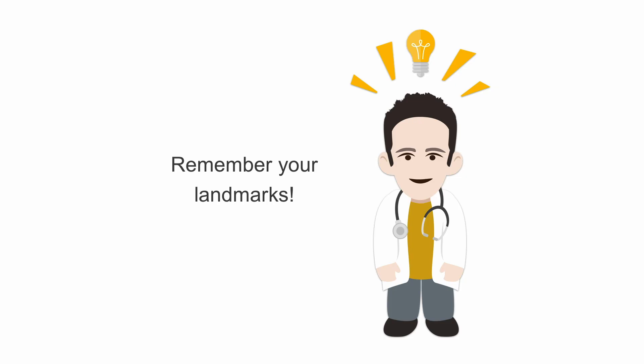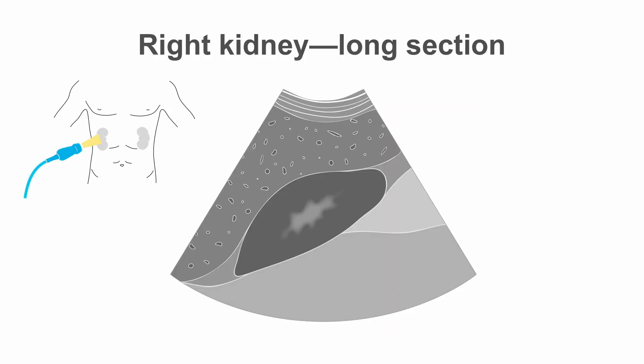There are two important structures to look for when trying to find the kidney. First of all, we will look to find the right kidney in long section. For that, we will look for the Morrison pouch.